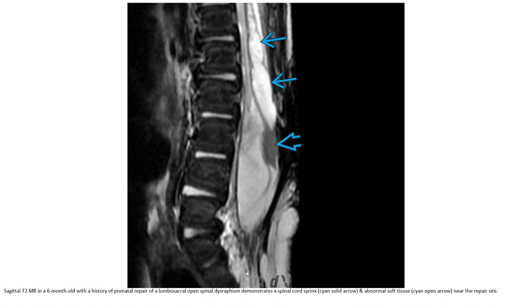This is a T2 image in a 6-month-old with a history of prenatal repair of a lumbar sacral open spinal dysraphism, demonstrating spinal cord tethering and abnormal soft tissue near the lumbar sacral myelomeningocele repair site.